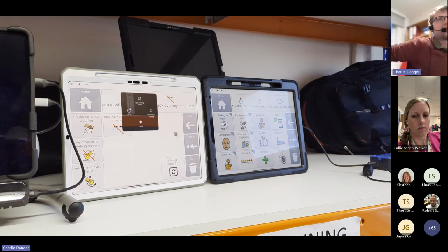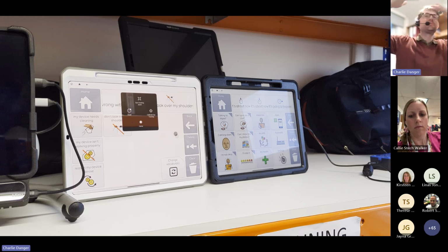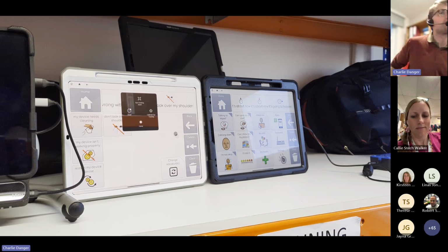It was a pain to use. It was very, very fatiguing. But then I thought what I'd do is I'd try taking the iPad and lifting it up so it's high in order for my eyes to be a bit wider open. I want to say that at this point I've also switched to the newer iPad, but I've also recorded videos of me using the older iPad in this position, and I couldn't see a difference for me between the newer iPad and the older iPad.